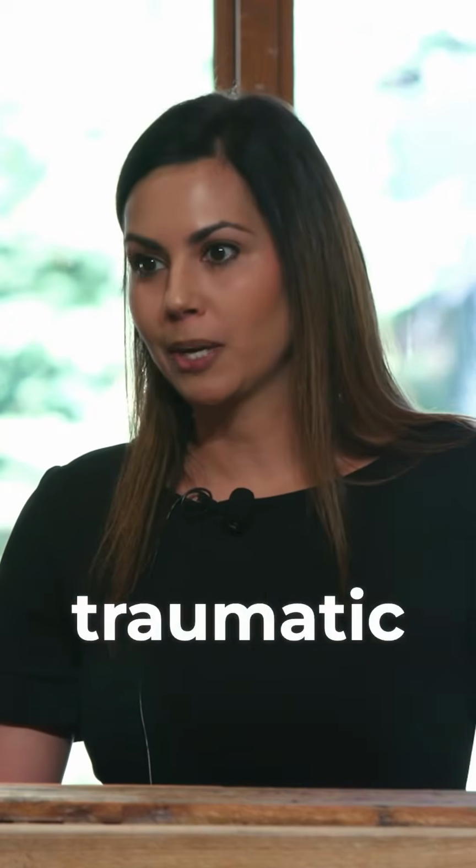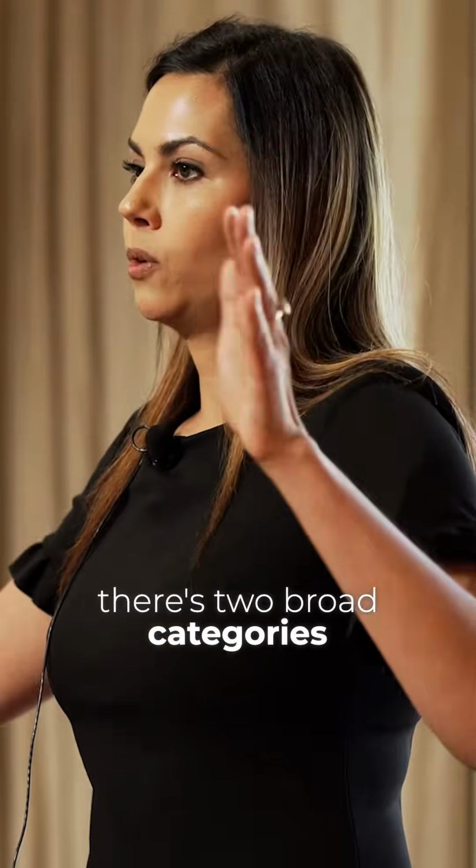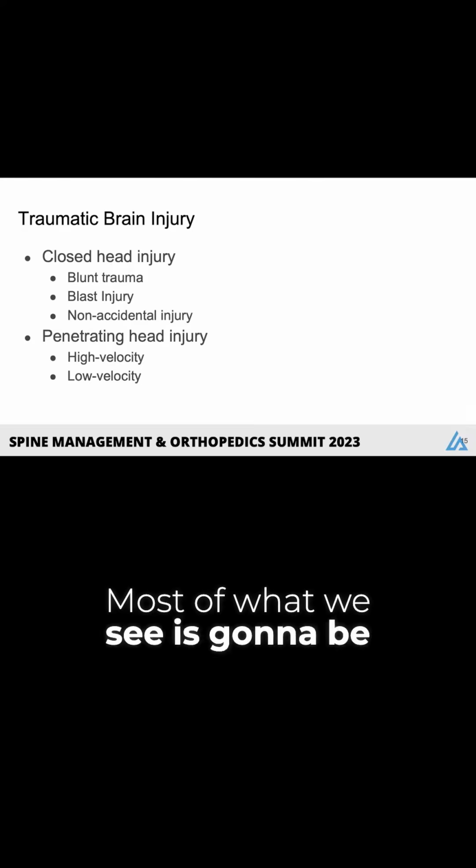Today I'm going to talk about traumatic brain injury and how imaging can help. Traumatic brain injury, or TBI, has two broad categories. There's closed head injury, and then there's open or penetrating head injury. Most of what we see is going to be closed head injury.